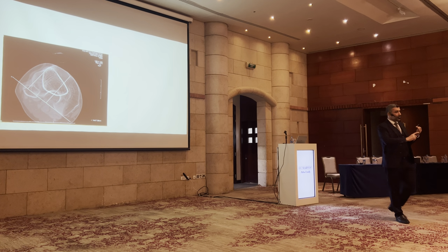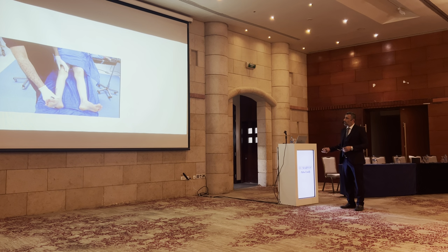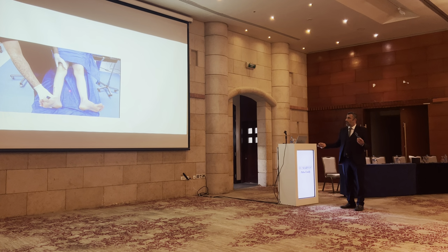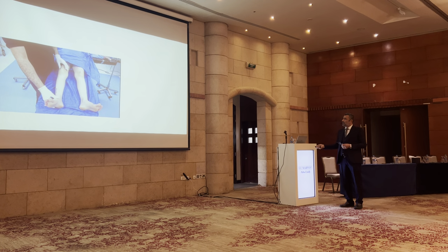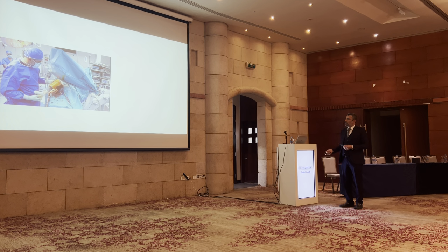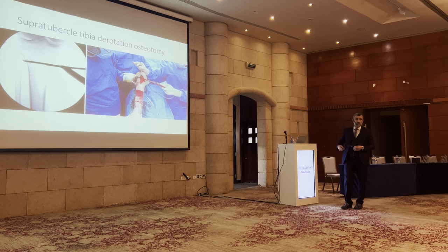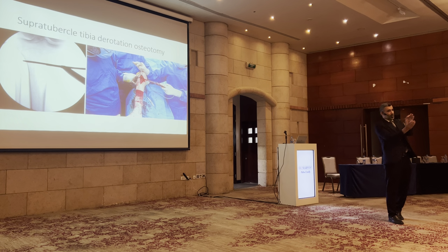So in a high TT-TG, with external tibial torsion and internal femoral torsion or high femoral anteversion, what to do? Look inside the operation, the patella is dislocated. And if you go there, look, where is the patella? This is the patella, not in the groove, it's dislocated. So what we did: femoral correction of the rotation, first step, and then after that, we did this supratubercle derotational osteotomy. By this supratubercle osteotomy, we corrected the rotation and moved the tibial tubercle internally.